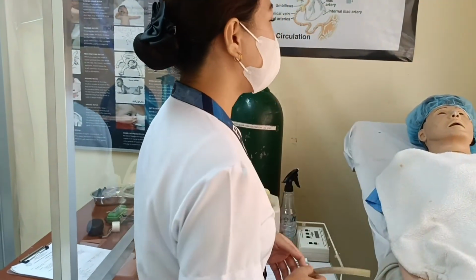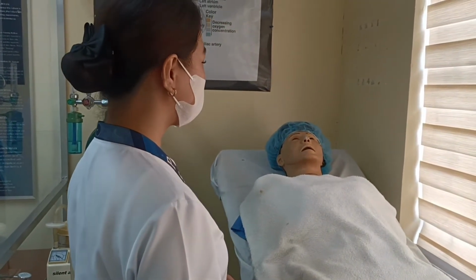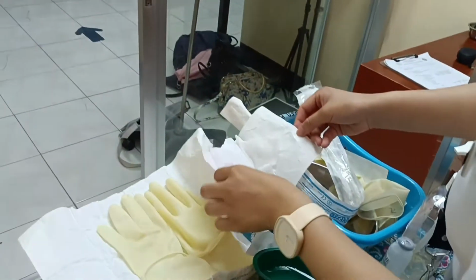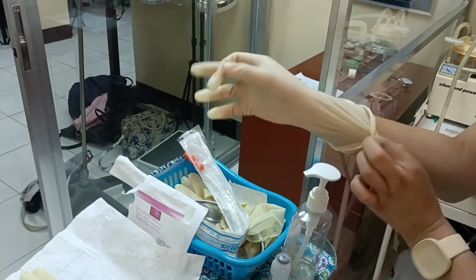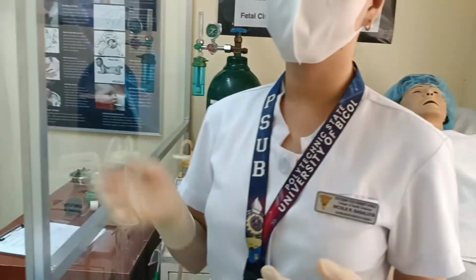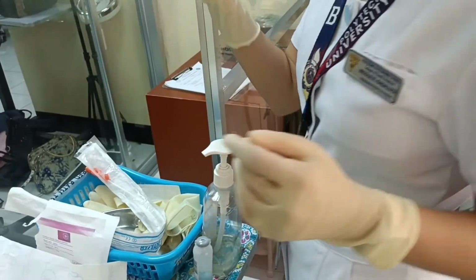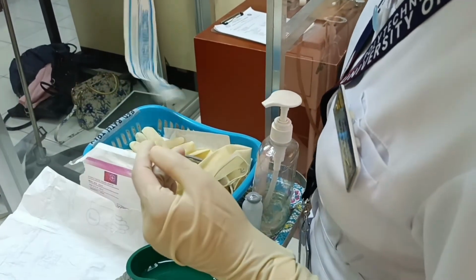Then next, we need to hyperoxygenate the patient. Ma'am, can you please inhale and exhale? Okay, thank you. Then we are now going to put on the sterile gloves. So our dominant hand is for the sterile, and our non-dominant hand is for the non-sterile. So using our sterile glove, we need to get the catheter.